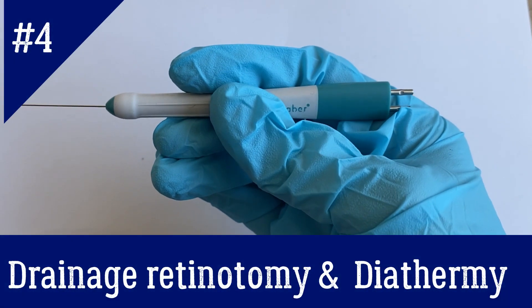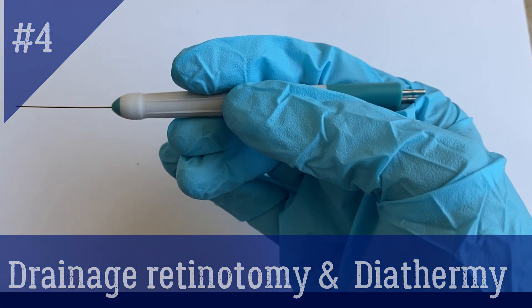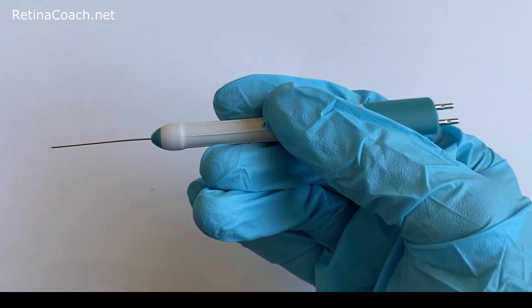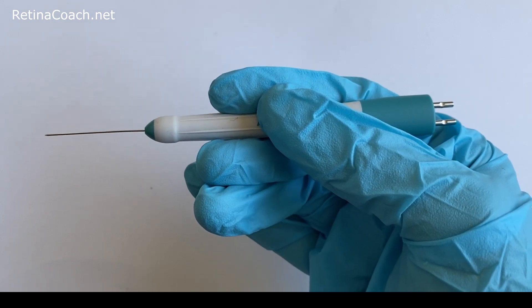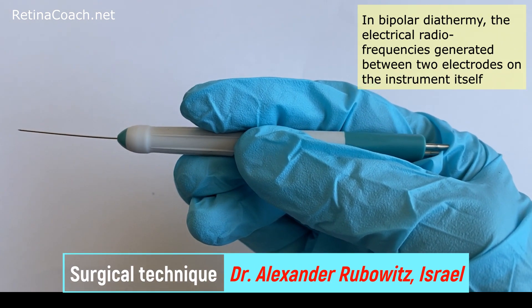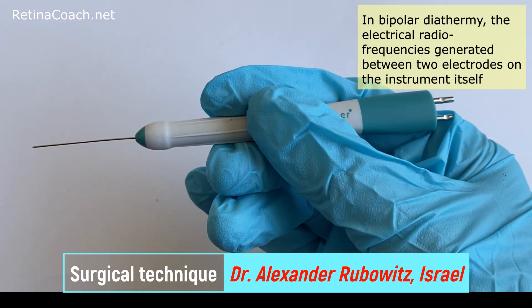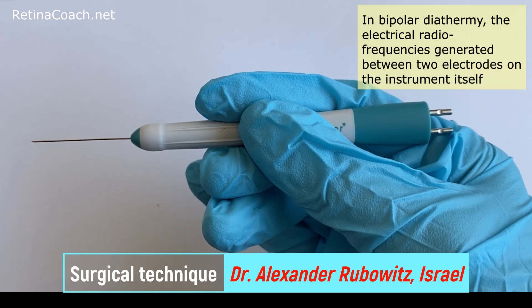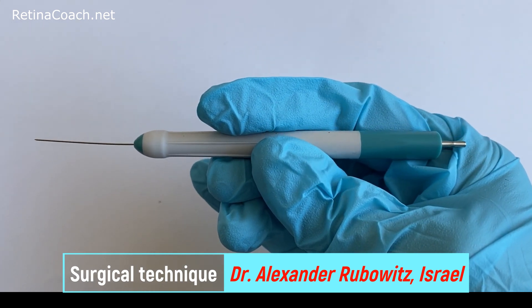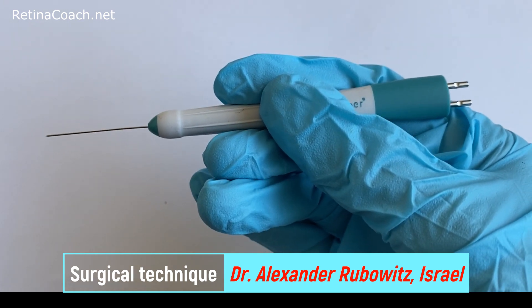This is Anfisa from RetinaCoach and today I will talk about drainage retinotomy and diathermy. Bipolar diathermy is used in intraocular vitro retinal surgeries. In bipolar diathermy, the electrical radio frequencies generated between two electrodes on the instrument itself, thus does not pass through the patient's body and does not require the usage of the grounding plate. This helps to minimize electrical interference.